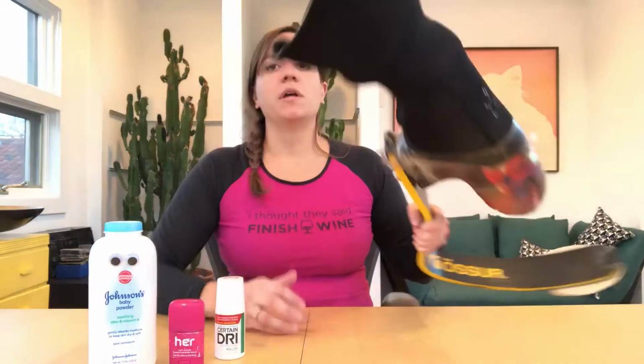Today's question comes from Pasha, and she would like to know how I deal with sweat on my residual limb. When I'm talking about sweat, I break my leg into two parts. This is my running leg, which I sweat in the most, so that's the one we're going to talk about. The part down here is the carbon fiber socket, and that's the part my residual limb goes into. I have different strategies for dealing with sweat there. Up here, which would be my thigh, is covered by this gel sleeve. I also have sweat issues with that, and that's actually where my bigger sweat issues come into play. I have different strategies for that, so I'm going to talk about both of those.